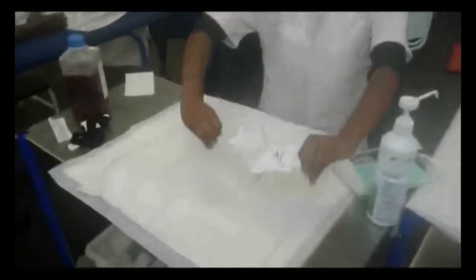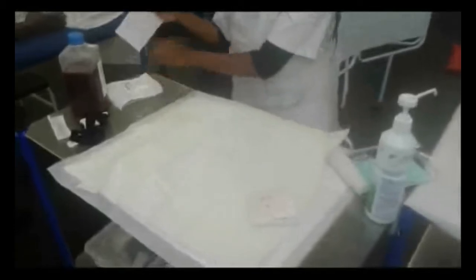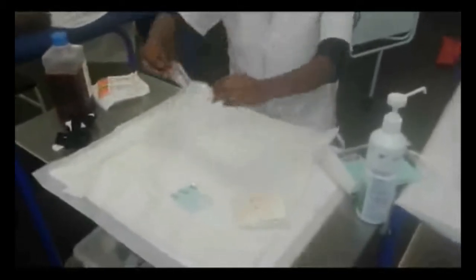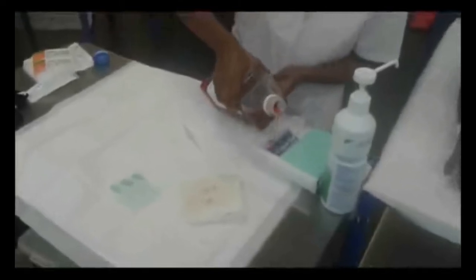Next, you will open all your sterile equipment onto your sterile field. You can open them in any order that you wish. In our video, we open our sterile gloves first, the opsite, and then lastly, we open the IV. Be sure not to forget your cleaning solution. In this case, we use chlorhexidine as our cleaning solution. Pour the chlorhexidine onto the swabs or gauze that is in your sterile pack.